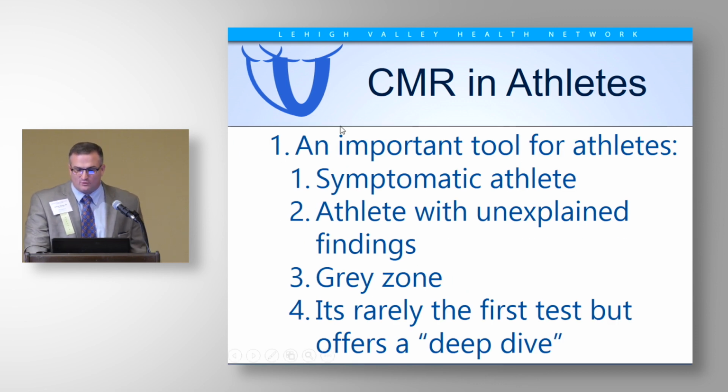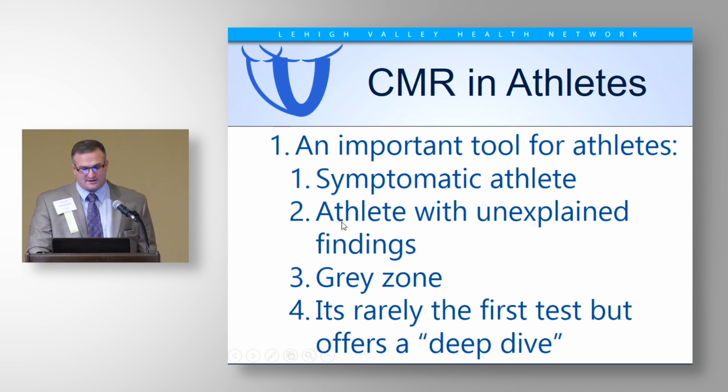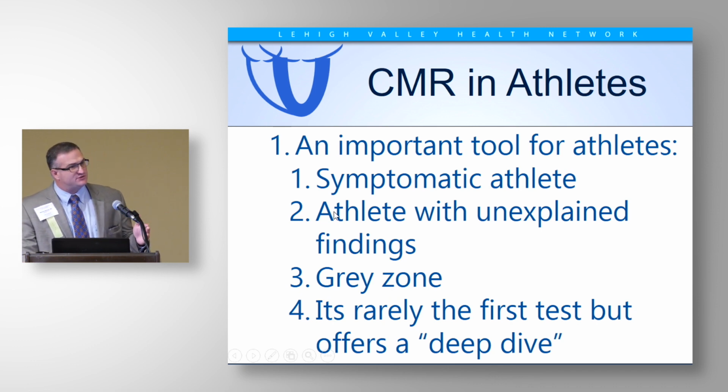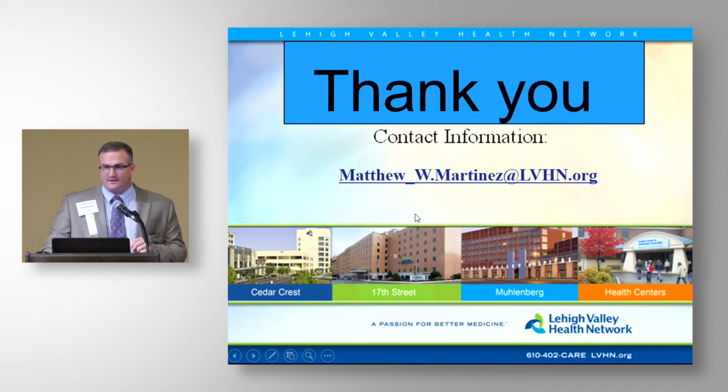I think it's an important tool for the symptomatic athlete. It's helpful for the athlete with unexplained findings and that gray zone, that 13, 14, 15 millimeter thick septum. I want to know how thick it really is. I don't think it's the first test you'll go to, but it should offer you a deep dive into that athlete that you may be losing a little bit of sleep over and that you have to be crystal clear about. And that's all I have.